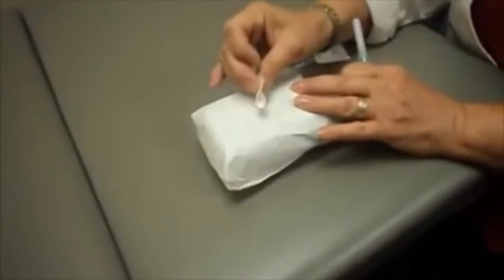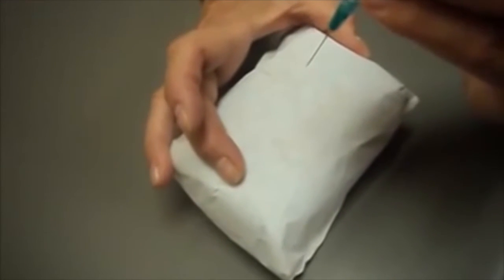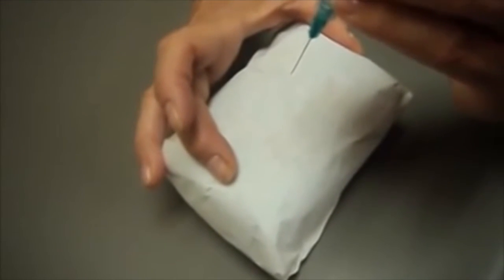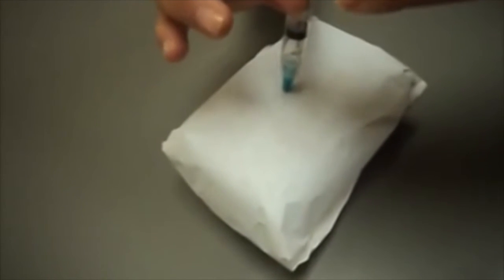Once we've picked our injection site, the next thing we're going to do is clean it with the alcohol prep. You clean from the center moving out, and you want to not touch the site where you're going to give the injection. Holding the syringe like a dart, if you want, you can stabilize the skin between your fingers. Your first finger is going to be on the top. I like to put the needle in not fast, not slow, but evenly, exactly like a dart. And you're actually going to dart the needle all the way in because this medication has to go into the muscle. So you dart it in, and when you've got it in, it will be stable.